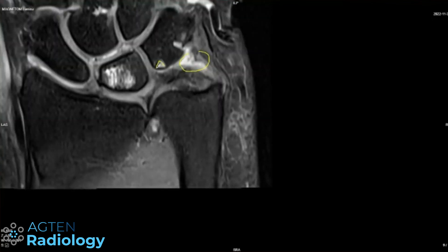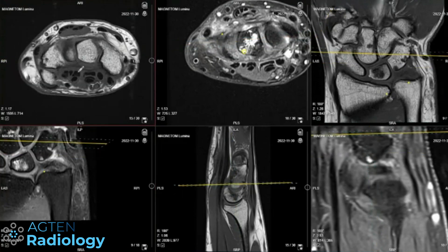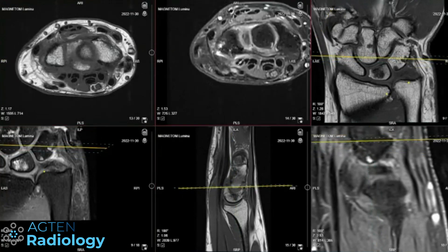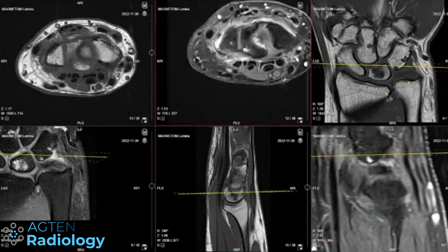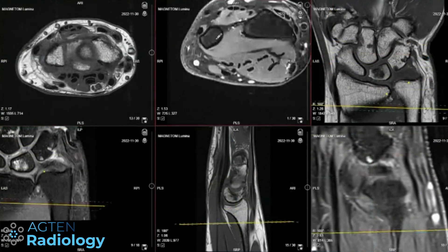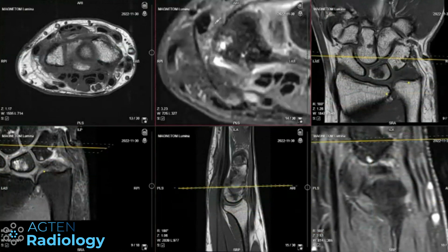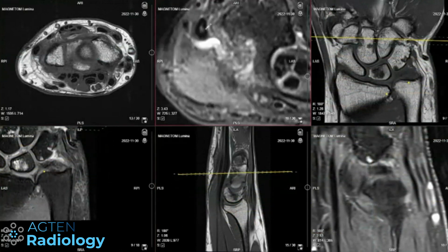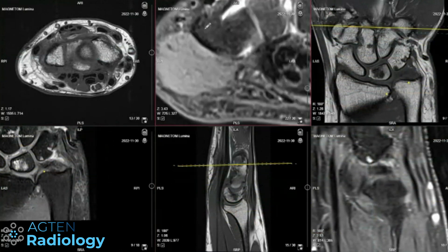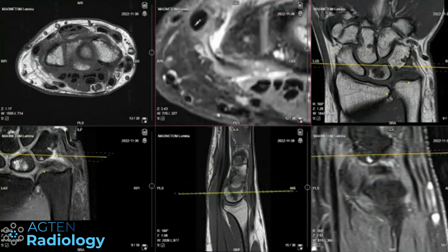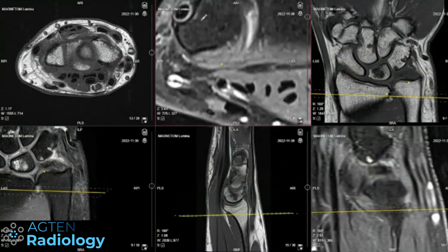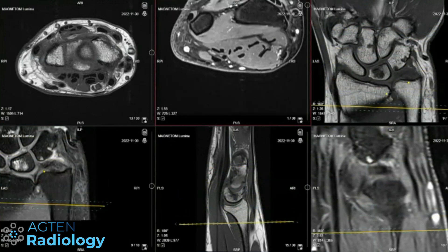The other thing we need to consider with ulnar-sided wrist pain would be the ECU tendon, but it looks actually not too bad. No tenosynovitis, some internal signal changes which are very common. This is the insertion — I would not make anything significant out of it.